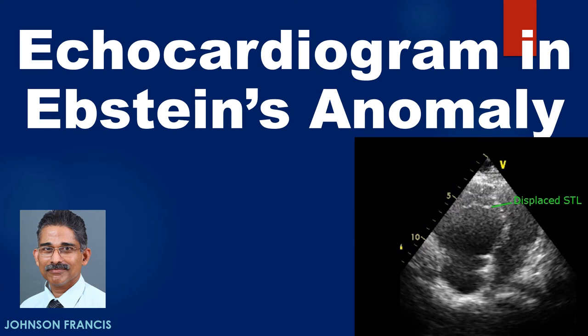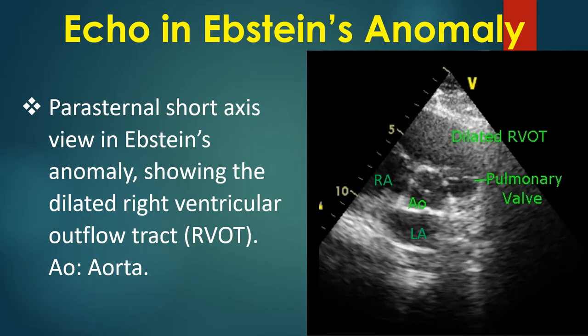Discussion on echocardiogram in Ebstein's anomaly of the tricuspid valve. Parasternal short axis view showing the dilated right ventricular outflow tract. Labeled structures include AO (aorta), LA (left atrium), and RA (right atrium).